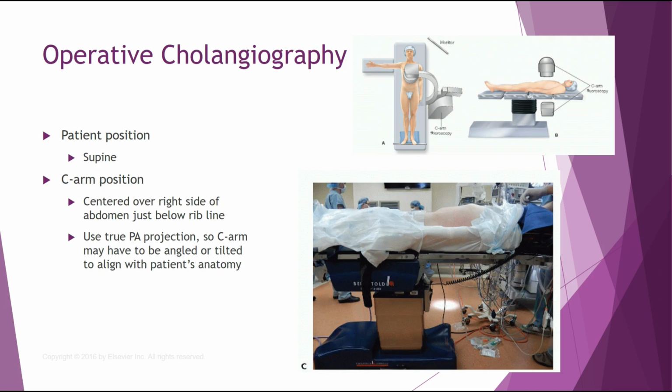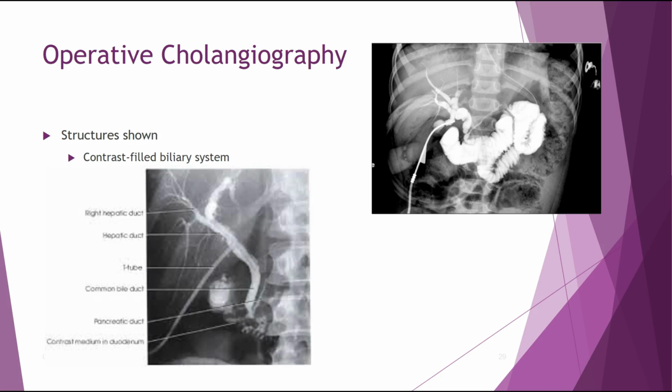A true PA, so the C-arm may have to be angled or tilted to align to the patient's anatomy. Just remember, you're going to use your X-ray eyes. Here are some pictures of a biliary tree system with contrast, and the surgeon's going to inject the contrast for you.